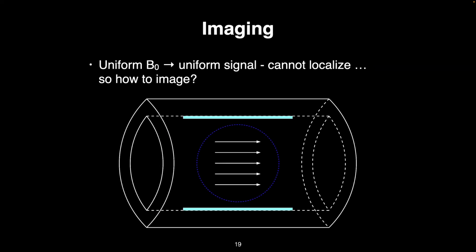So this is representing that case where we have our magnets, which are usually these long cylindrical tubes. The field that a magnet is defined to have is usually in a ball of some defined diameter at the center of that magnet. So even if we have a 7T system, it's only 7T in about a 40 to 50 centimeter ball right at the center of the system.